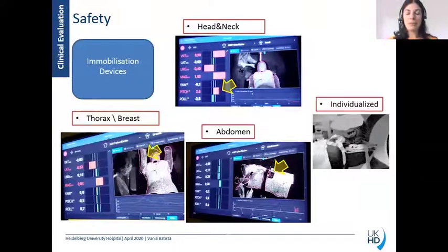In the case of patients that have pain and you need to place some pillows, for these patients it is now quite easier to set up, compared with without Align RT, where only 3 points are not enough to give all the information of everything that you need to put in the specific position to have the best agreement between planning CT and the treatment for each fraction. Of course, with Align RT you can also treat patients without immobilization devices.